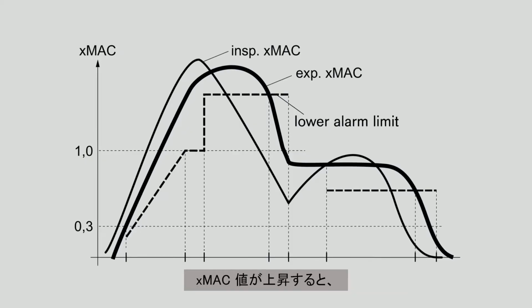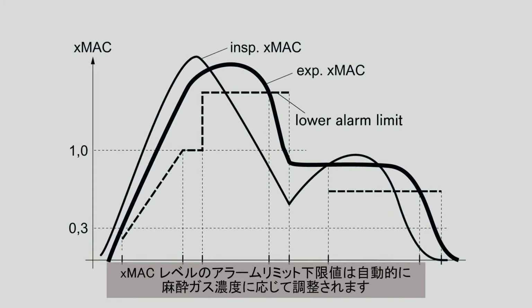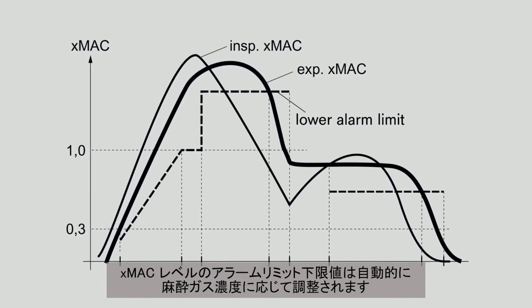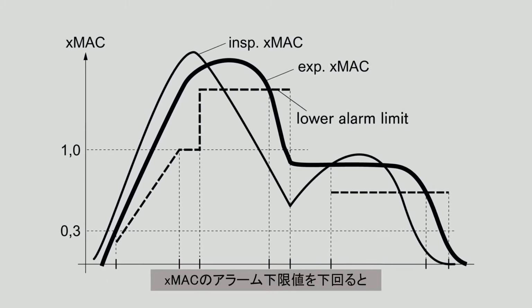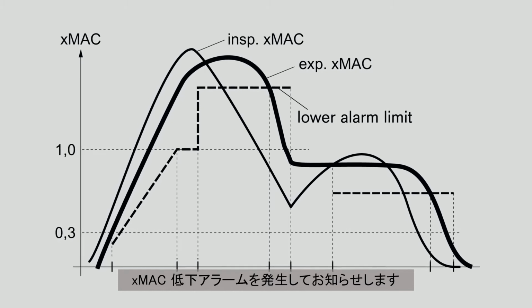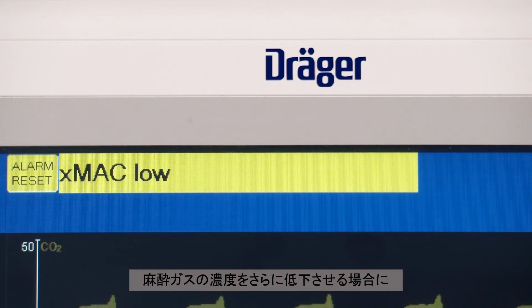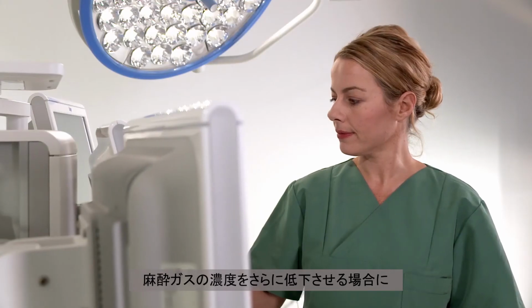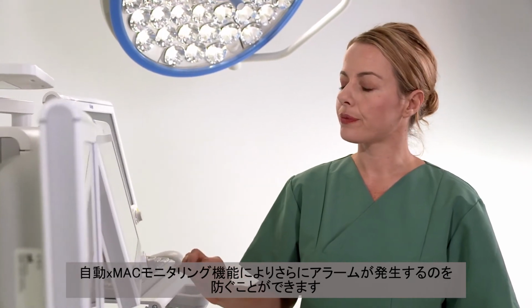When the XMAC exceeds the alarm limit, the level is automatically adjusted to the level of the volatile anesthetic agents used. After the XMAC falls below the alarm limit, you can acknowledge the alarm that was triggered. By acknowledging the alarm, you can prevent any additional alarm in automatic monitoring mode if you intend to further reduce the anesthetic gas concentration.